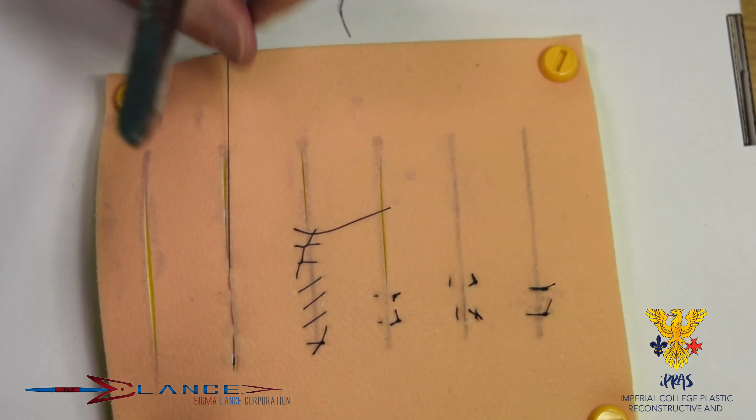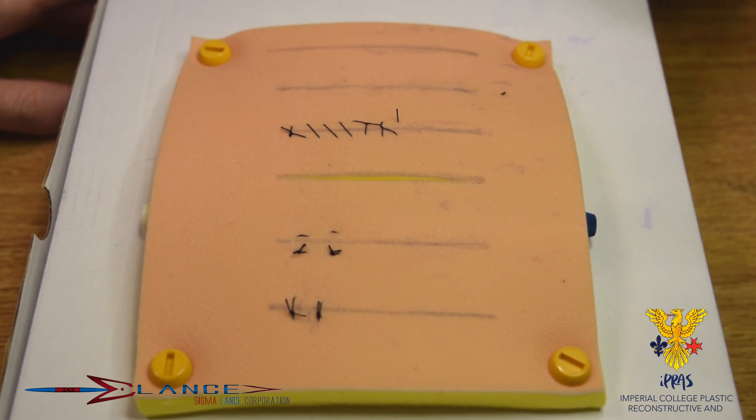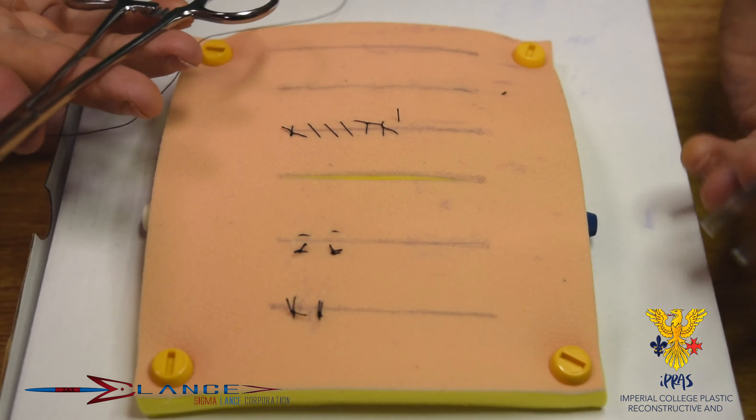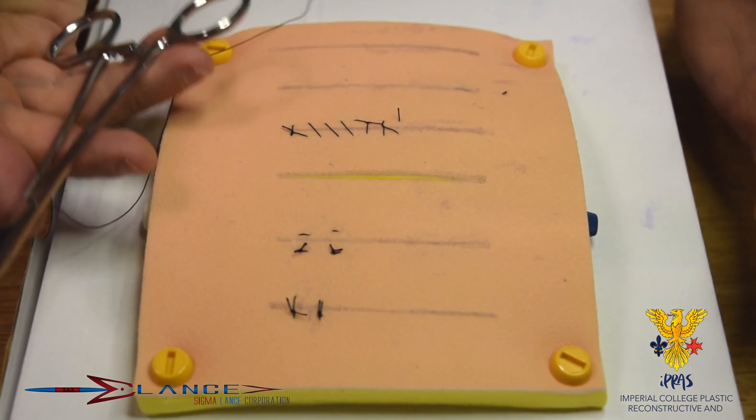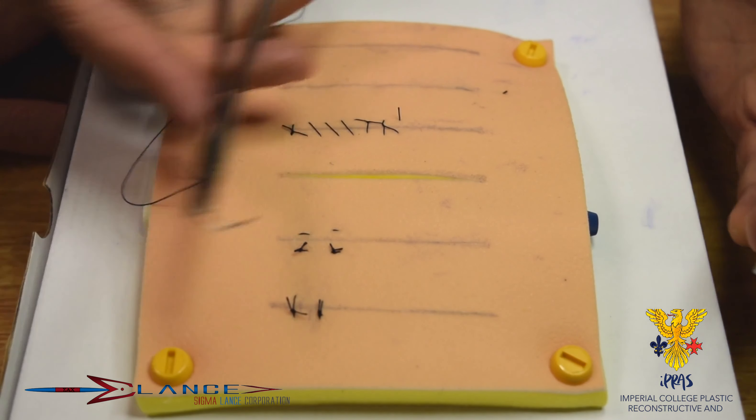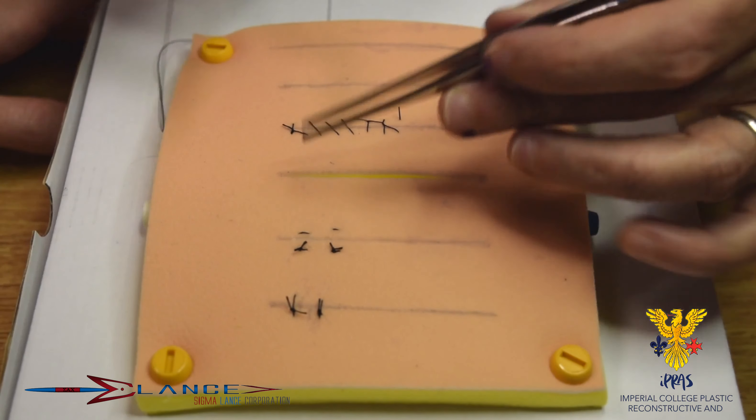We'll do that maybe perhaps at the end. Okay, so we're going to demonstrate the subcuticular stitch again. Just talking about where hands should be, how the wound should run, really the wound should be running at 90 degrees to your hand, so that's the natural way of closing the wound. Any other way makes the closure much more difficult. So you should be square onto the patient.